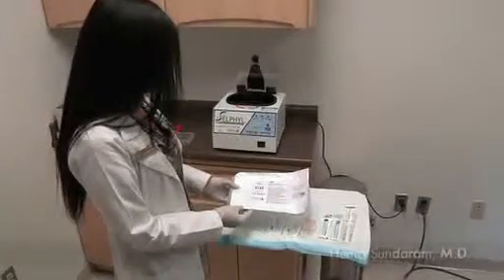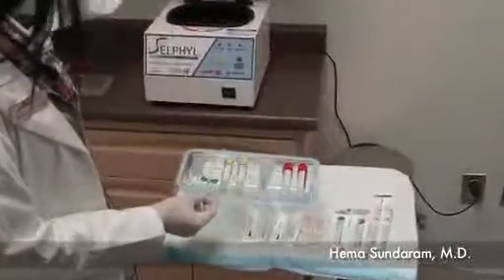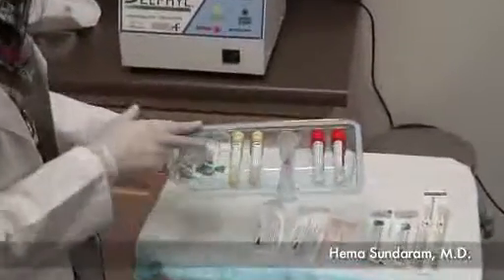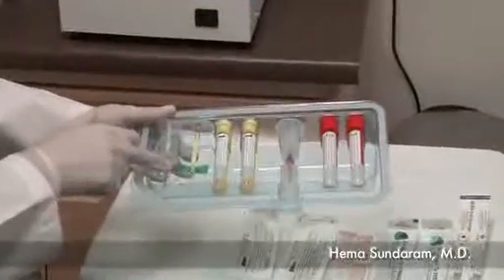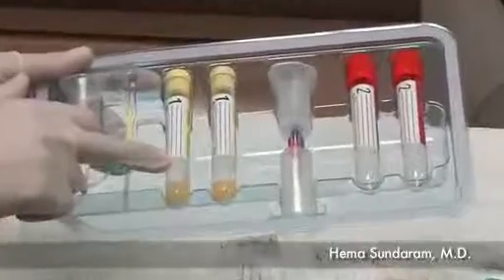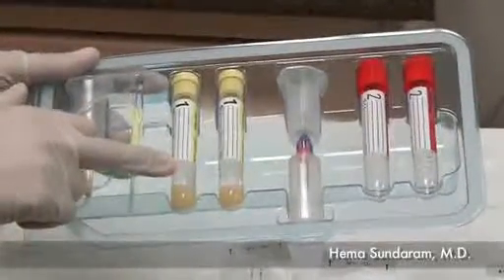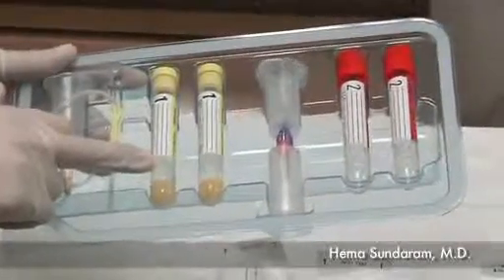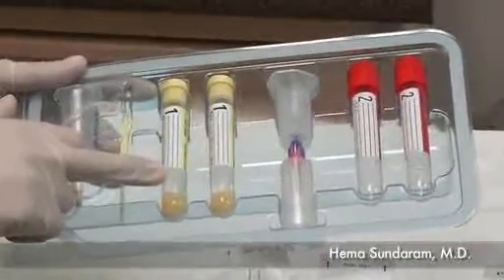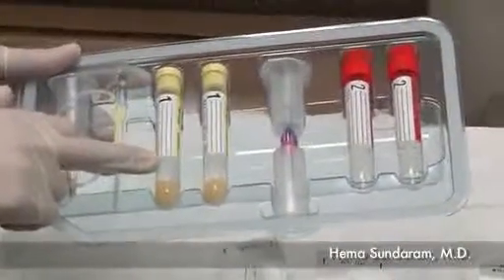This is the platelet-rich fibrin matrix kit. It contains a butterfly needle for drawing blood, and the blood will be drawn into this yellow top tube which contains sodium citrate for anticoagulant effect. The tube will then be spun in a centrifuge for 6 minutes to separate out the red blood cells and the white blood cells, which will be discarded.